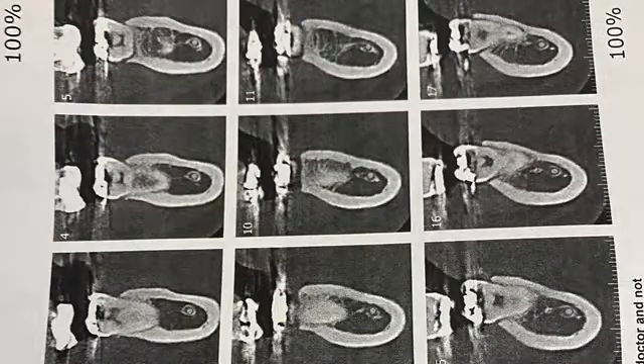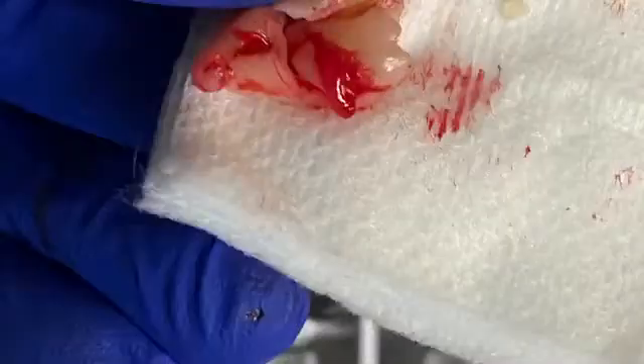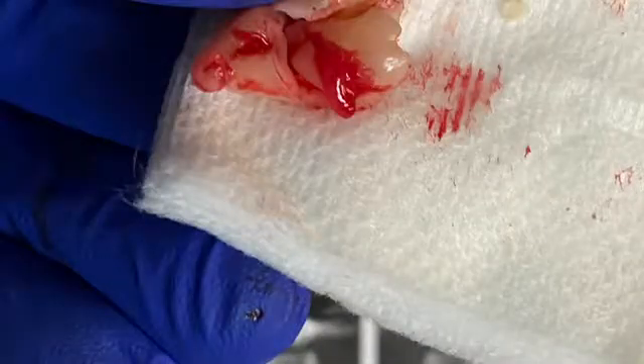So it is safe to remove if you know what you're doing. These are the CT scan images showing you the different angles. Let's take a look — the tooth came out in three pieces.